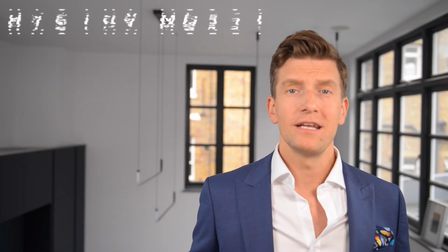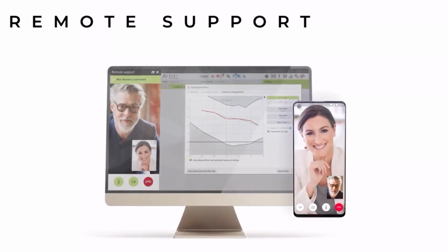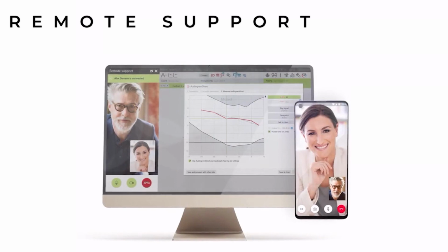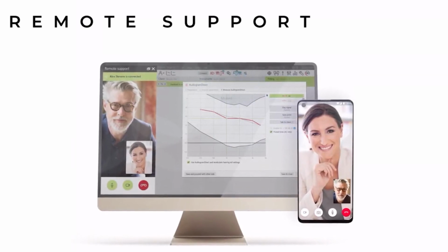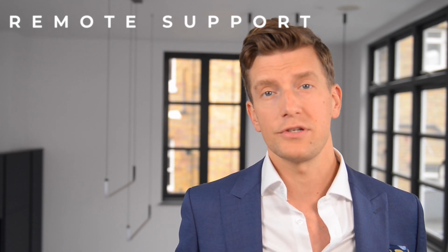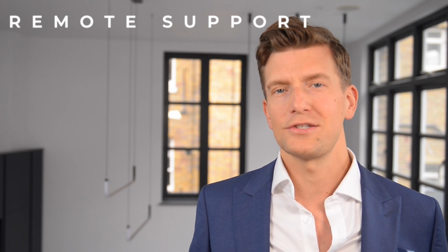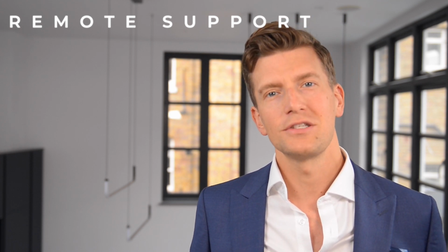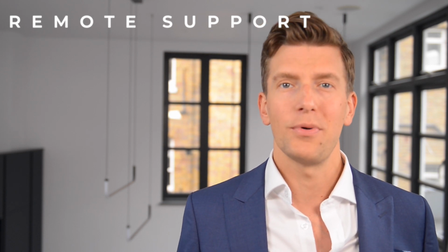One great feature that I've really made the most of over the last 18 months is the remote adjustments feature. And what this allows me to do is to log on to the patient's hearing aids through their smartphone and make adjustments to the settings on their hearing aids. I can be sat there in the clinic and they would be sat at home on their sofa, or even better, they may be in a situation or a place where they're struggling to hear, and I can make changes and we can have a live understanding in terms of whether those changes are having a positive impact.